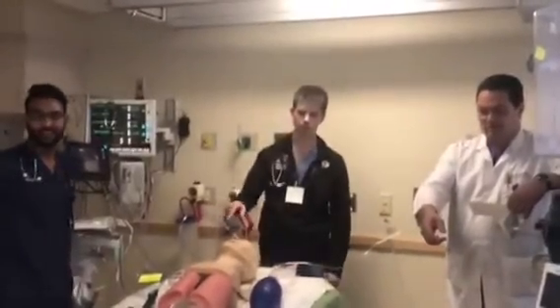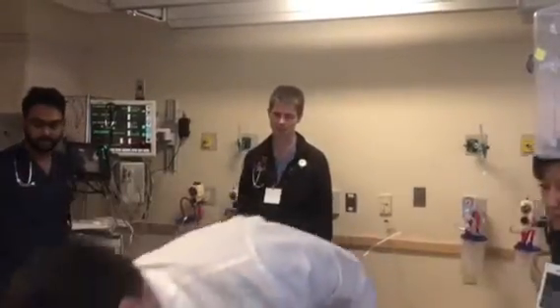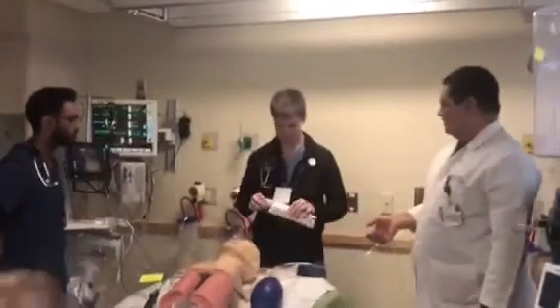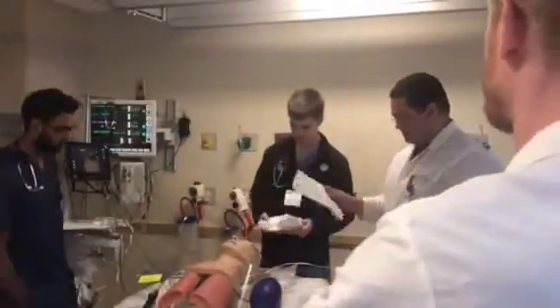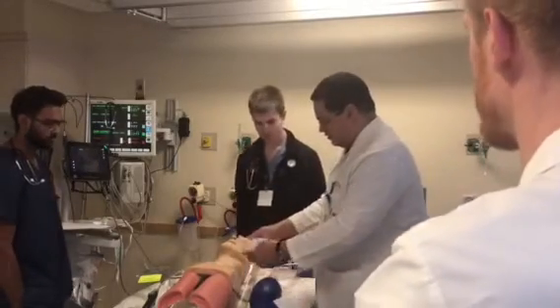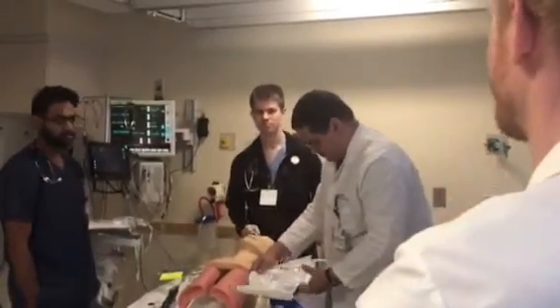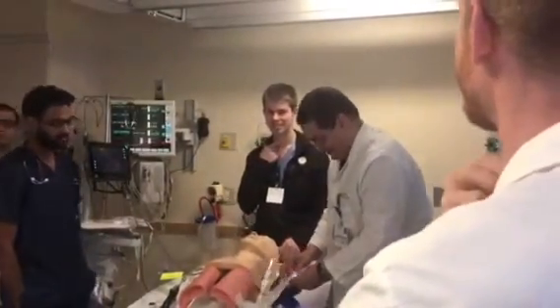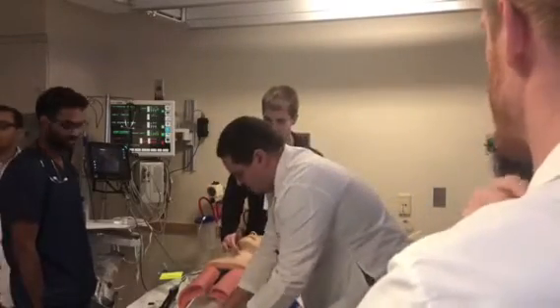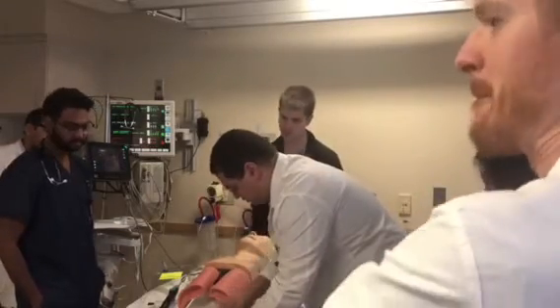And in the meantime, we'll be prepping the. Is it still prepped from the? Yeah, it's still prepped. Even if it's not prepped, what are you gonna do? Okay. So we're gonna show the needle cric. This kit I needed because we need to open it anyway because we need it for education. So. Yes, we do. Right. So we need 10 cc's of lidocaine. This guy is awake. He's partially awake. So yes, you have. So we're getting 10 cc's of lidocaine.